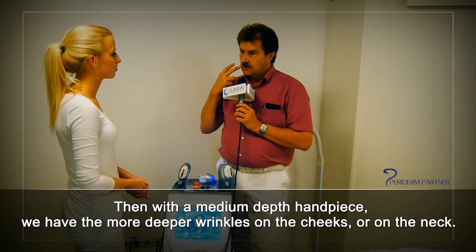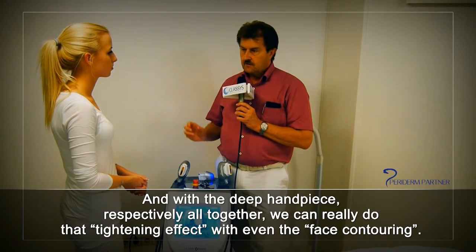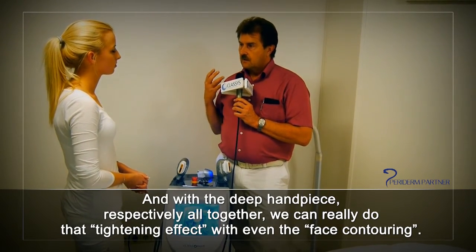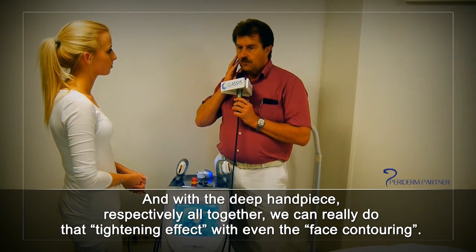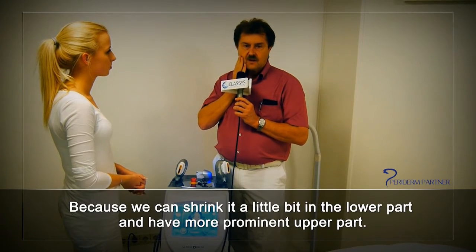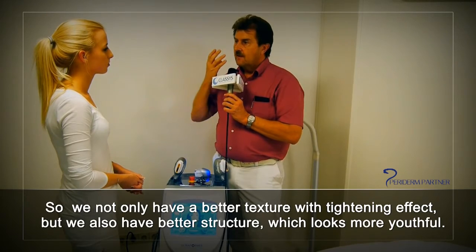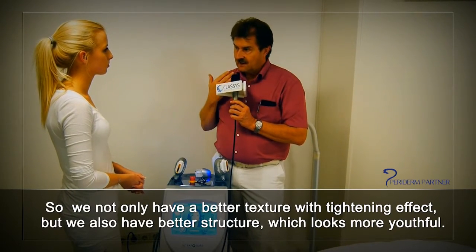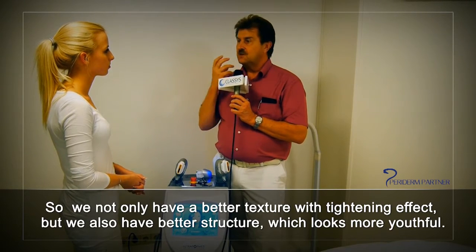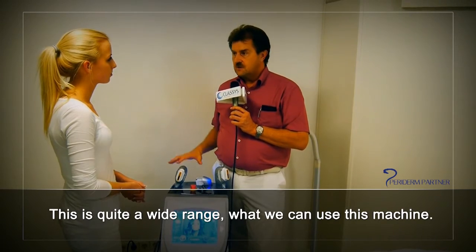With the medium depth handpiece, we treat deeper wrinkles on the cheeks or on the neck. With the deep handpiece, we can achieve a tightening effect with even face contouring — we can shrink the lower part a little and have a more prominent upper part. So we have not only better texture and tightening but also a better structure which looks more youthful.